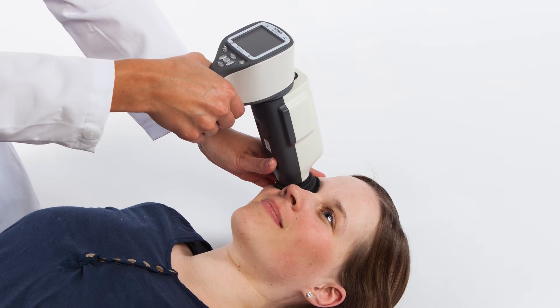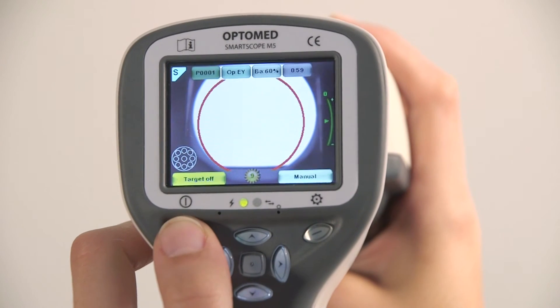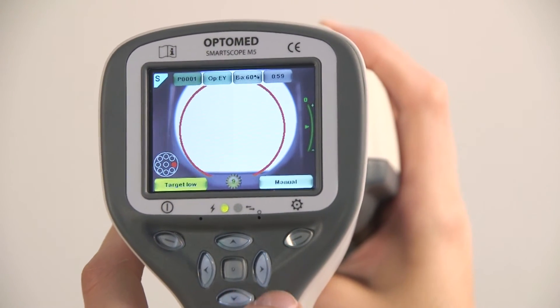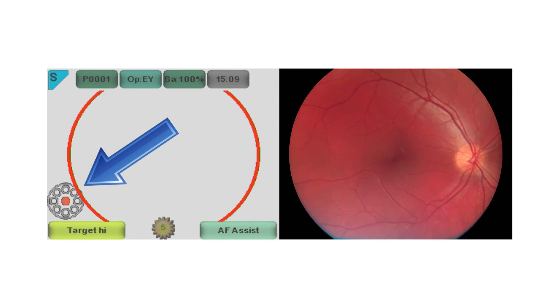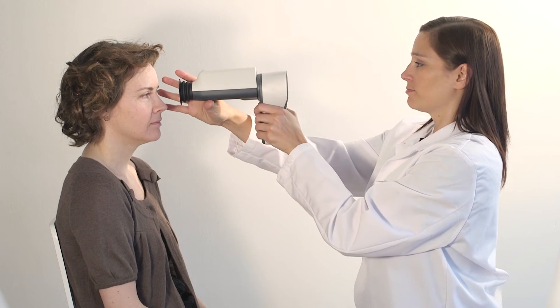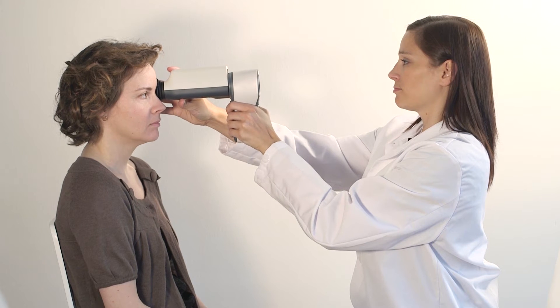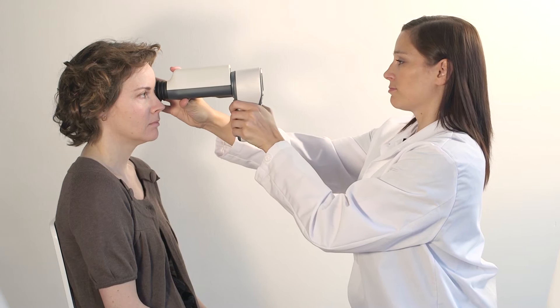The patient is asked to stay still and look at an internal fixation target. Activate the internal target by pressing the left soft key, and move the target by using the arrow keys. To achieve a macula-centered image, select the middle target. To achieve an optic disc-centered image, select either the right or left target depending on which eye is being imaged. Hold the camera with one hand and support the optics module with the other, keeping the hand against the patient's forehead.